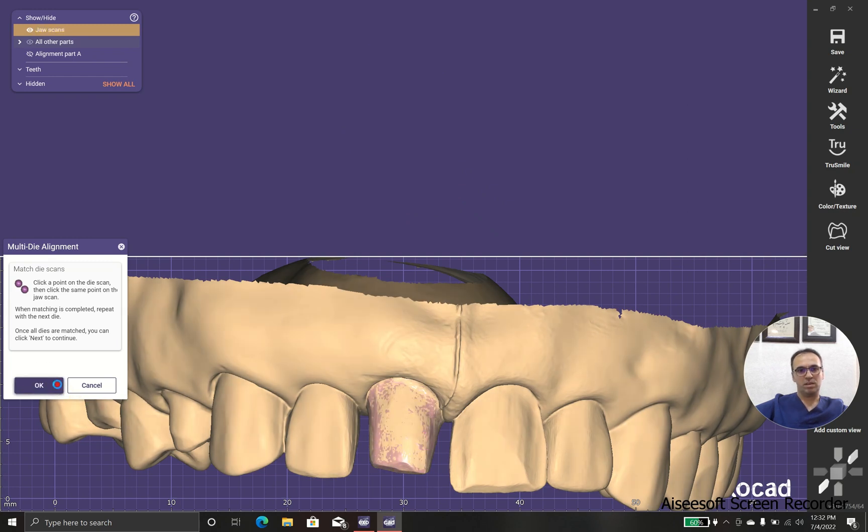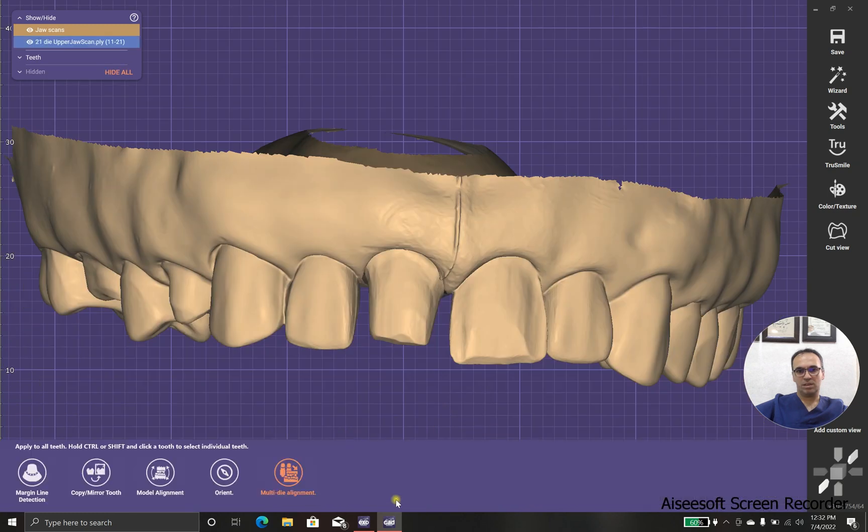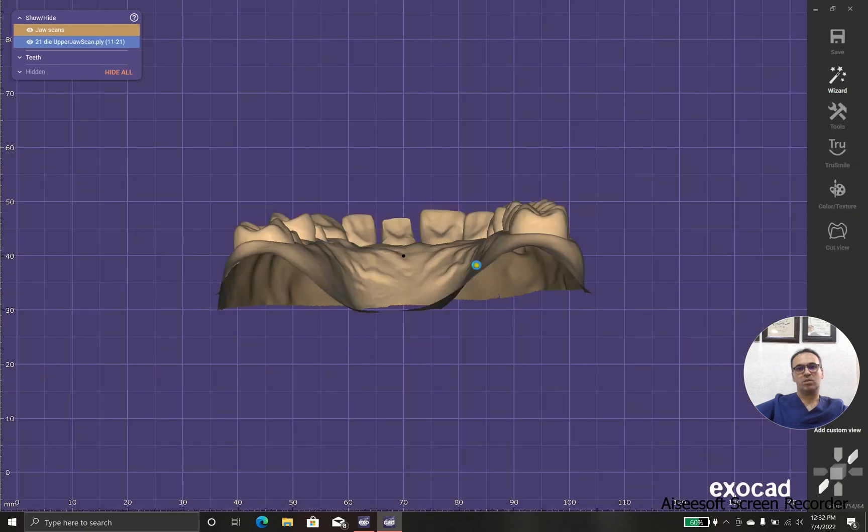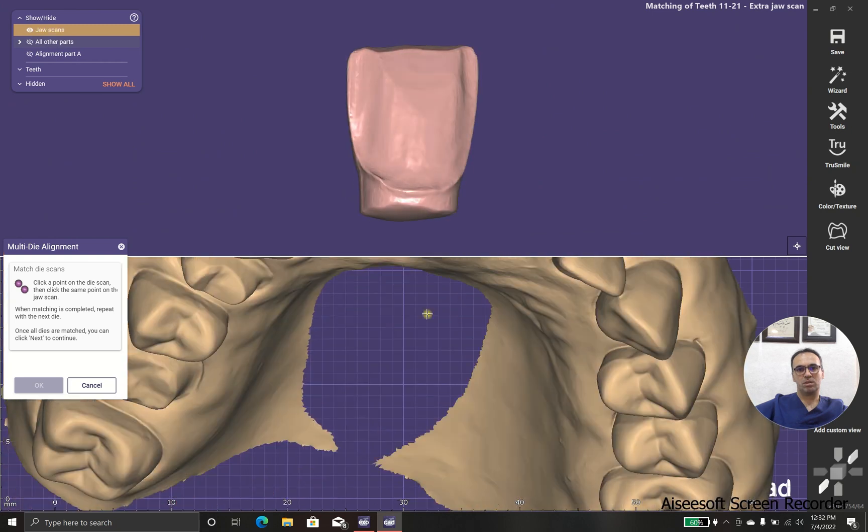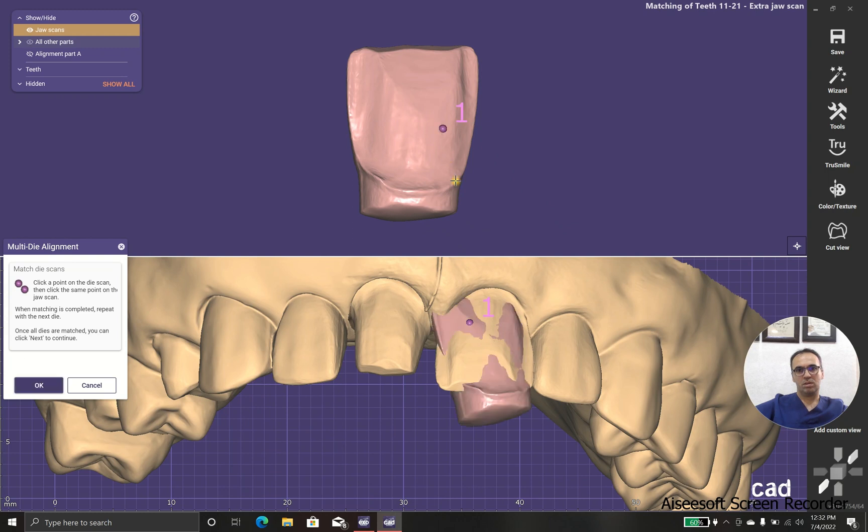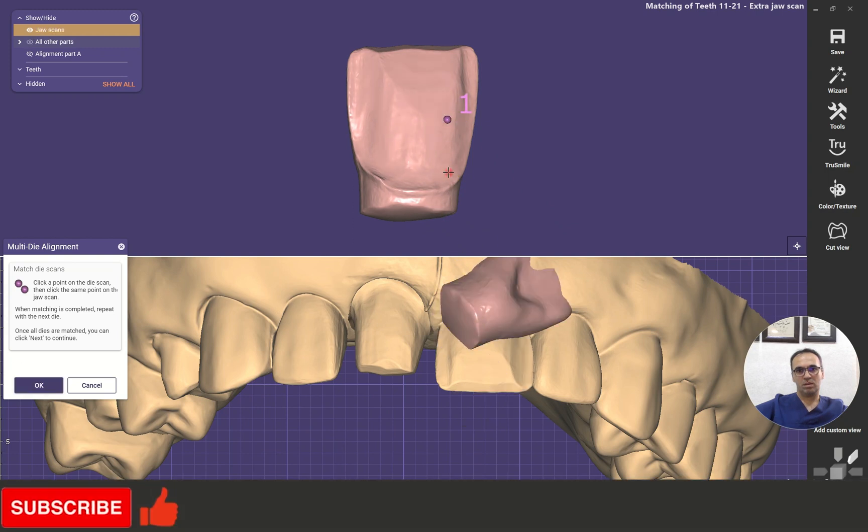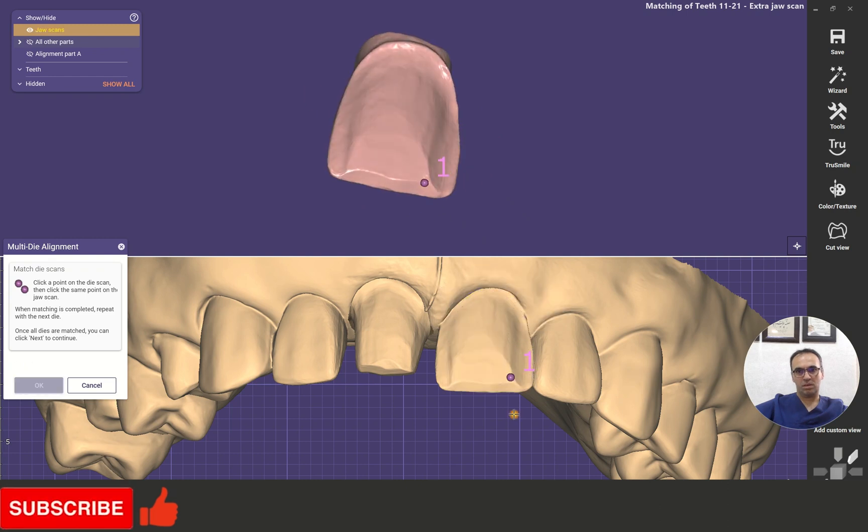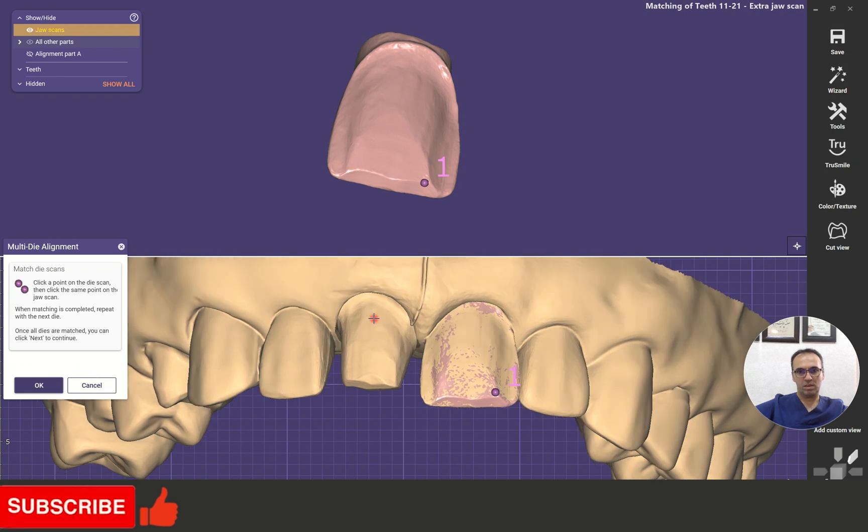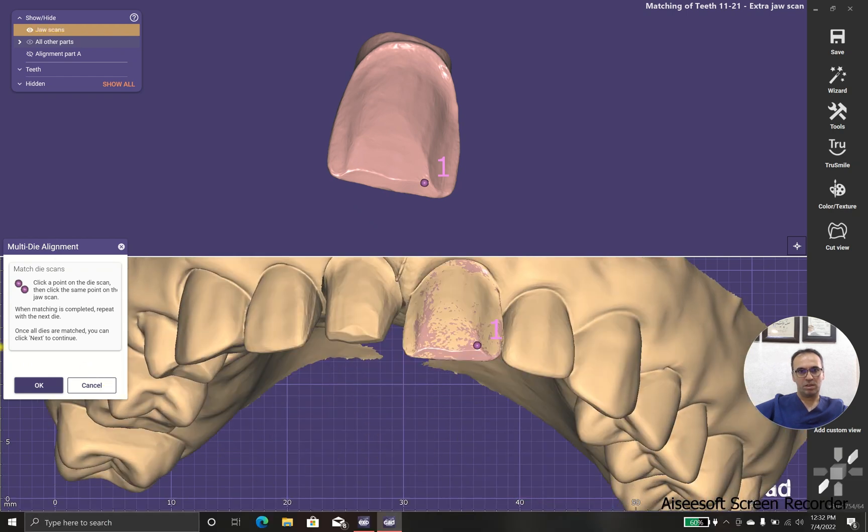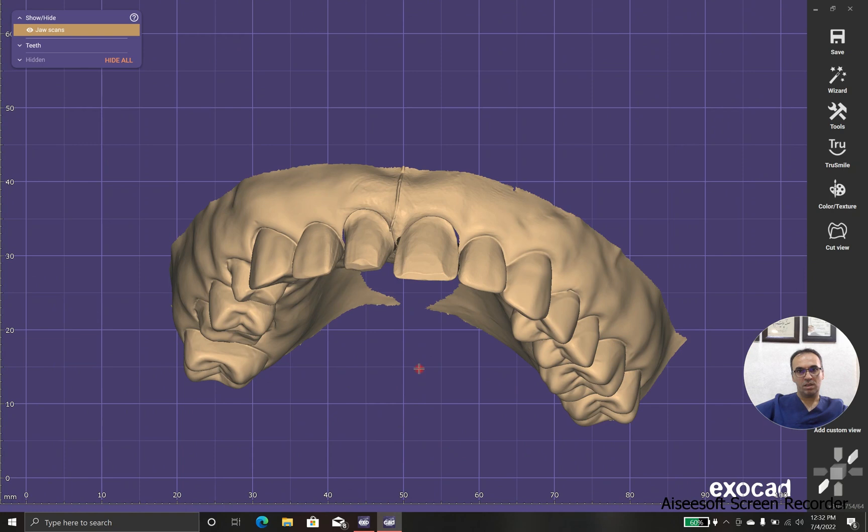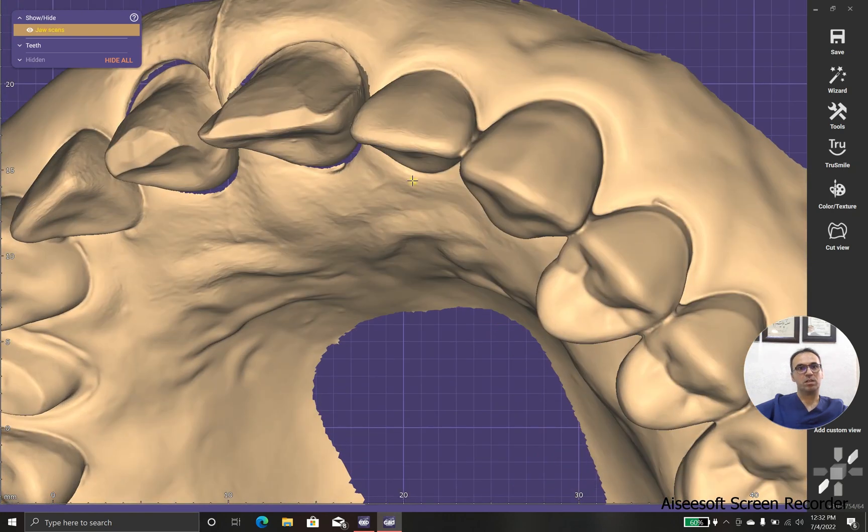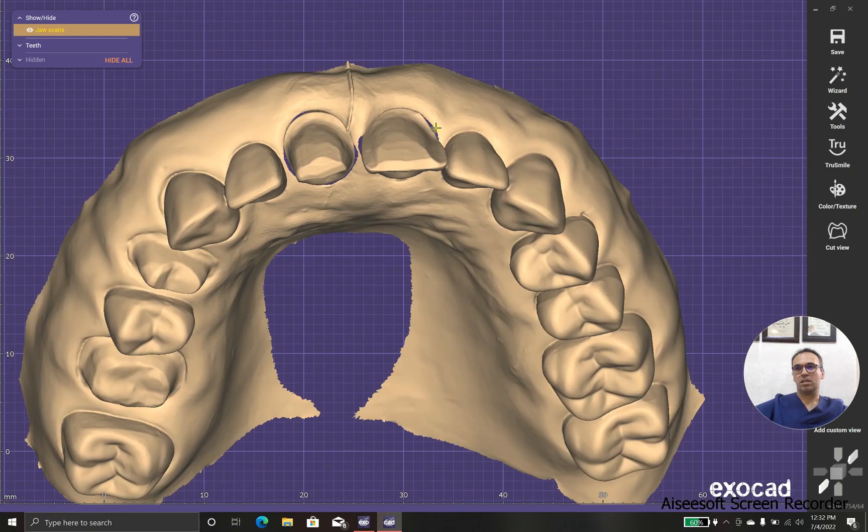And the second one, tooth two. It should be something like this, and as you can see, some part of the margin is hiding underneath the gum, okay.